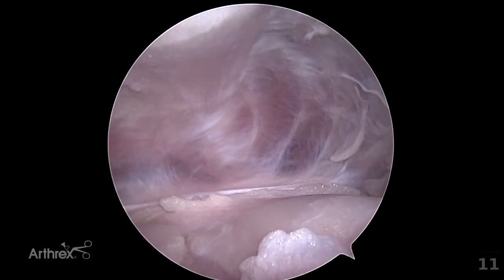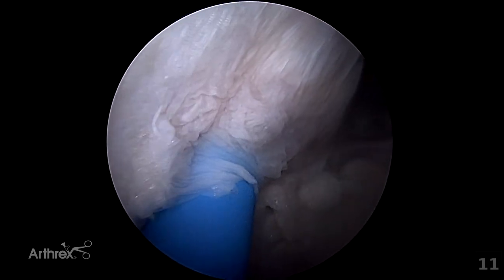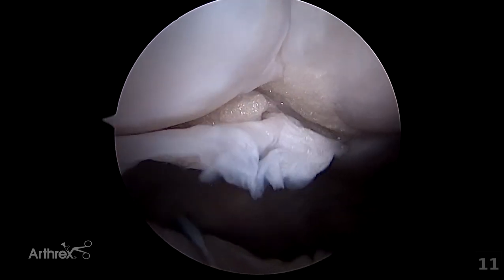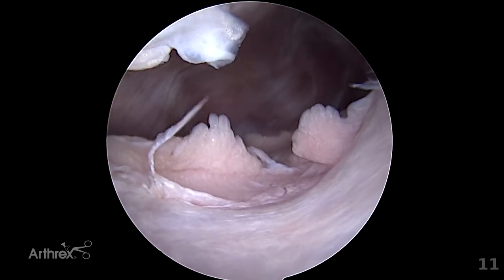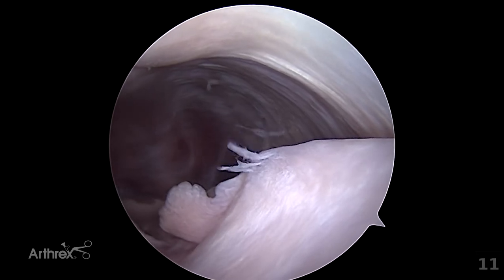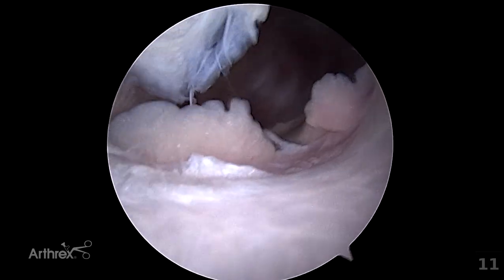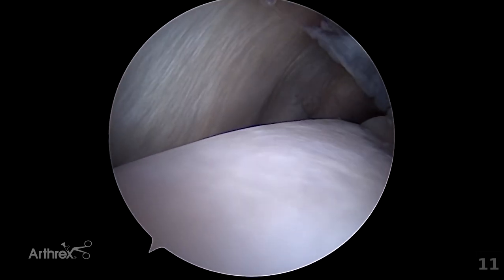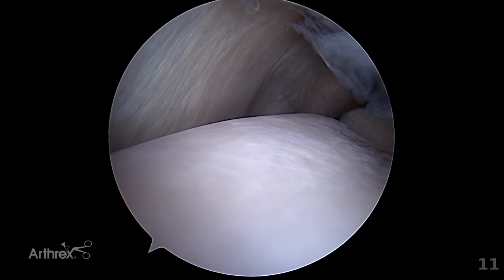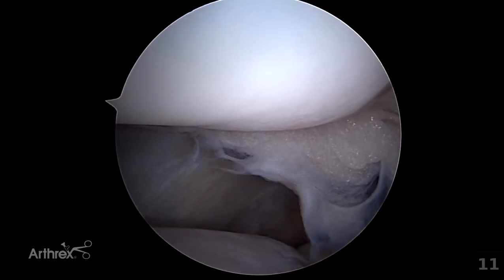By gently moving the scope further distally, the egress cannula, the quadricep tendon, the proximal pole of the patella, the proximal portion of the lateral femoral condyle, and the medial femoral condyle can be assessed. Evidence of medial patella luxation and associated damage will be seen on the medial femoral condyle and on the undersurface of the patella.